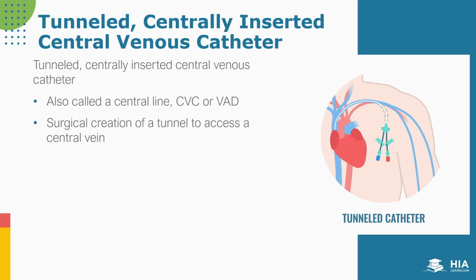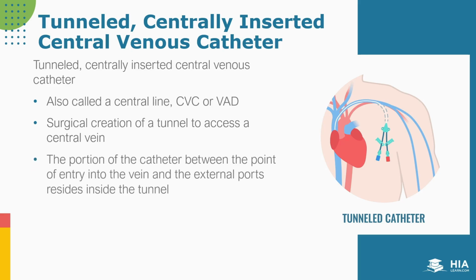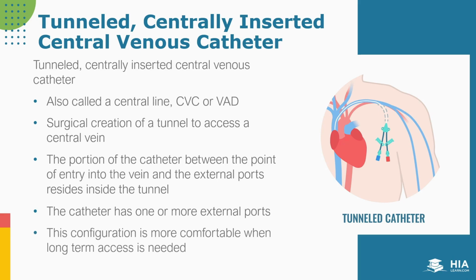For these devices, a portion of the catheter resides under the skin and exits at a point elsewhere on the body, usually the lower chest, ending with ports that are external to the body. This configuration is more comfortable for patients who will need long-term access.